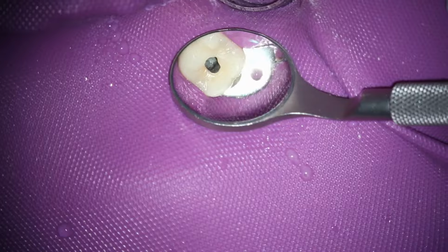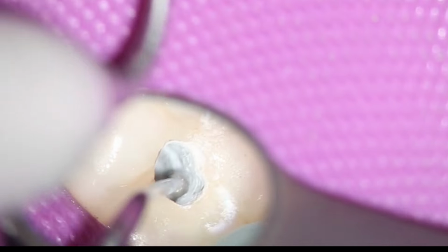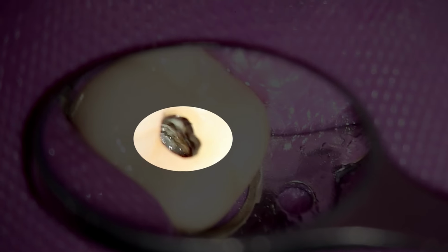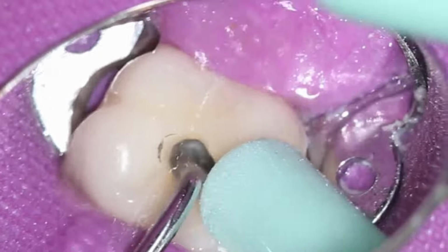So the mirror is going up close to the tooth when you really need fine detail, and it's further away towards the bottom of the dam when you're actually drilling and worried about the water spray. So now I have to find the distal buccal and palatal canal, and it looks in the radiograph as though they are connected. And then when I look in there carefully, I can see the calcified pulp along that axis.